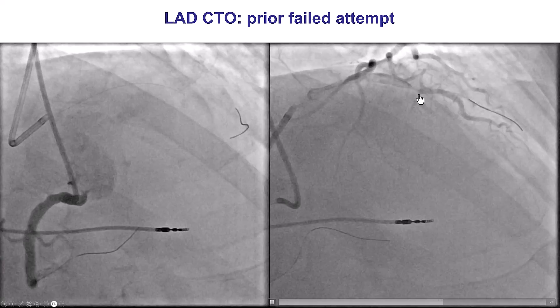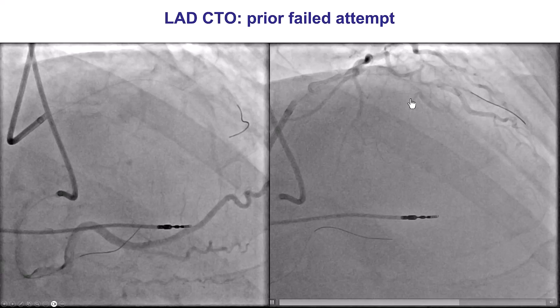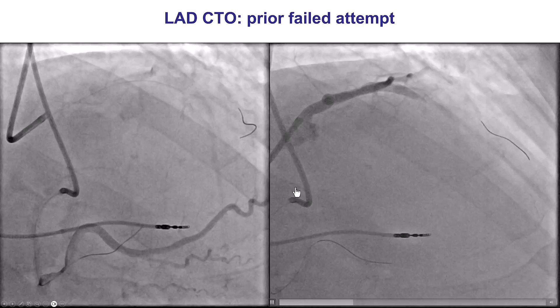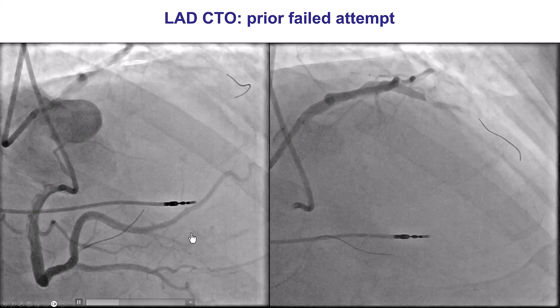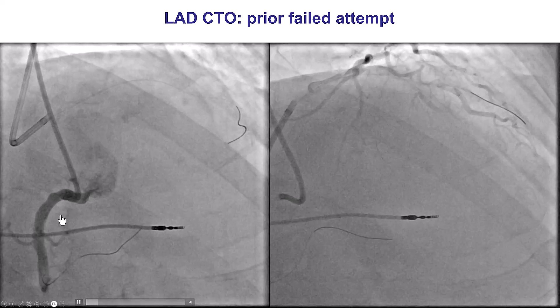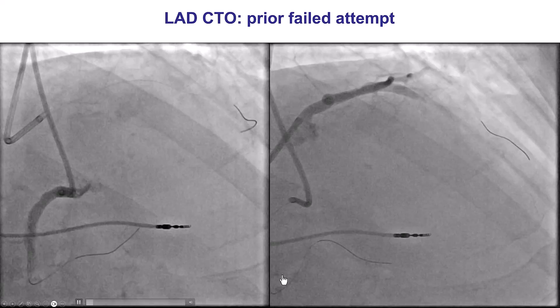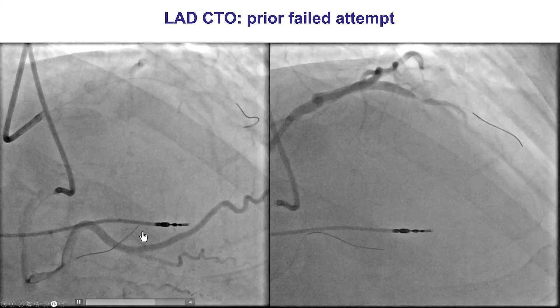Looking at the characteristics of the occlusion, there may be some trickle of flow through the proximal cap. There is a bifurcation at the proximal cap, and the length of the occlusion is very short. The distal vessel is relatively poorly visualized and fills via septal collaterals. Notably, the safety guide wire in the donor vessel was in a very small branch — important to recognize this and reposition the wire to prevent distal vessel perforation.